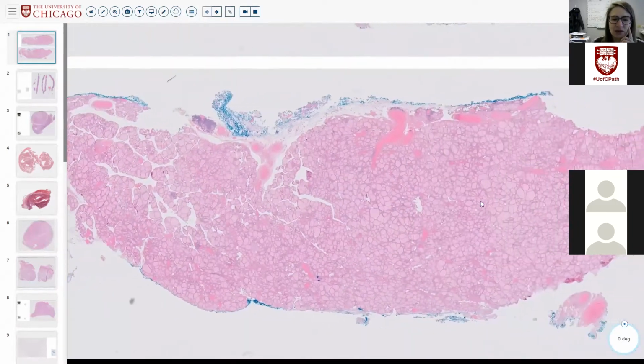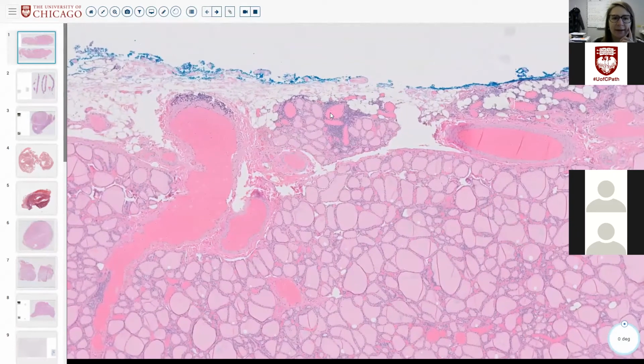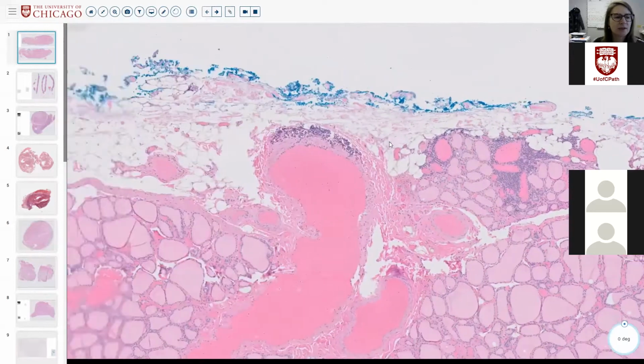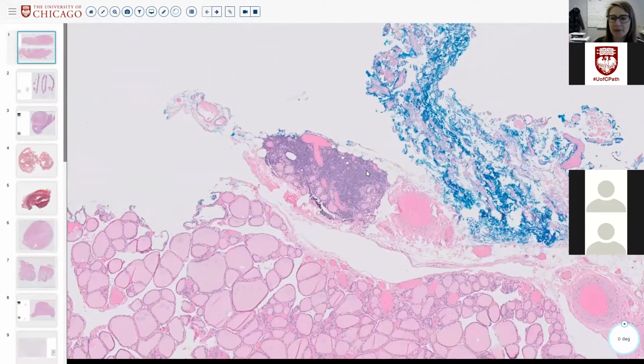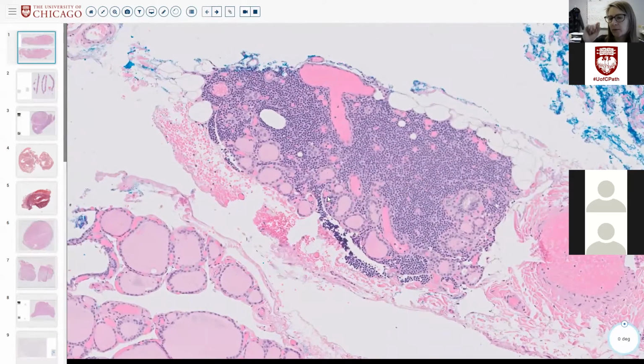Yeah, so my point here is we have to be cautious with lymphoid areas near and around the thyroid. Here's another one that's more follicle-rich and lymphoid-poor, but still has a combination of follicles and lymphocytes. I point this out because this is going to happen, where a surgeon plucks out one of these little lymphoid nodules and they don't know what it is.